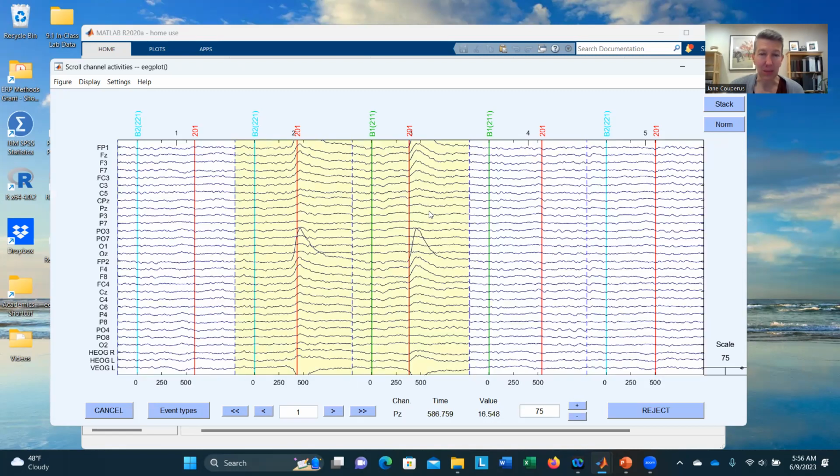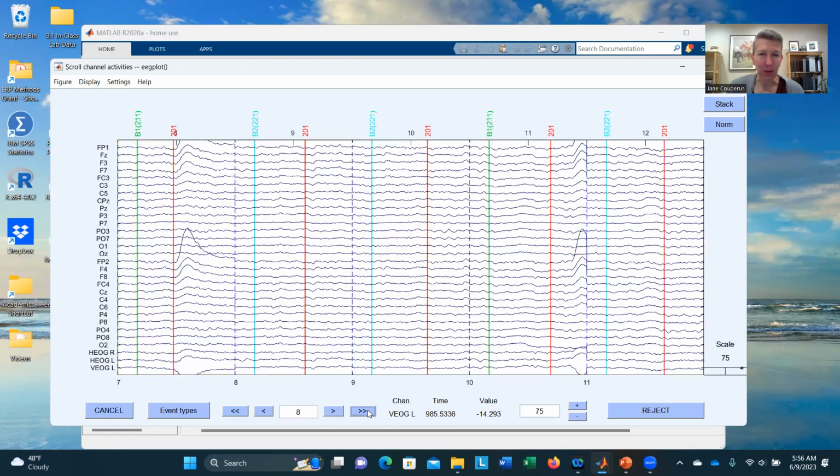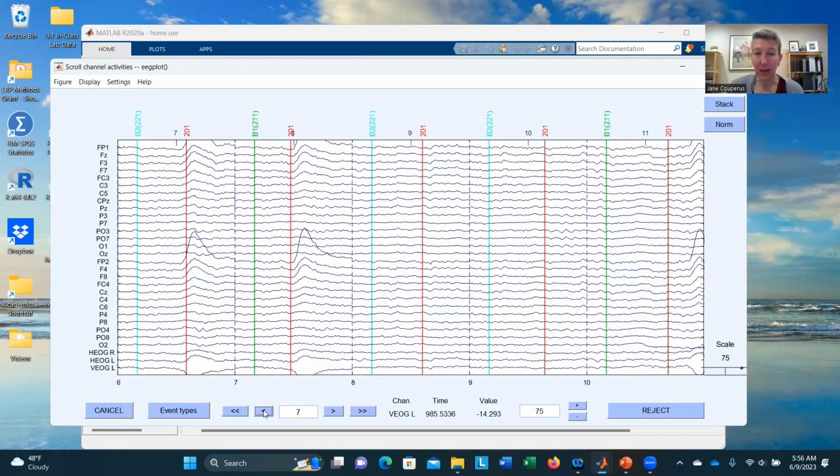Maybe I decide this one's a blink, but you have to do this throughout the entire thing. So you can go second by second, or you can move several at a time, but you are going to need to go through the whole thing. One thing to note though, is you might decide that actually, I don't care about these blinks. Yes, it's a blink, it's an artifact.